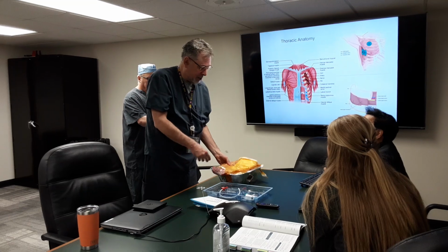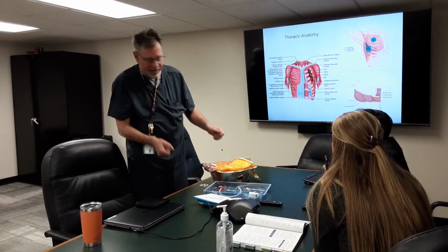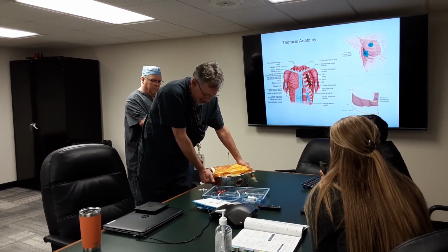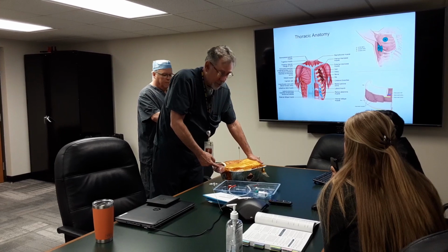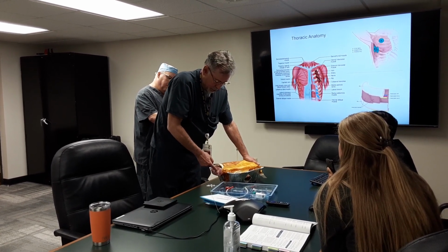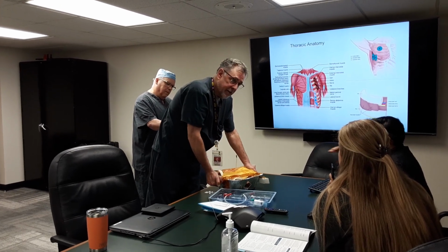Yeah, well, the idea was that this would go over there, and this would go over there, and everything would be tight, and what's happened is that this is not very tight. When I do this again, we'll just have somebody hold it. What I'll do is take a big number 1, suture that, suture this, and just tie it on the bottom.